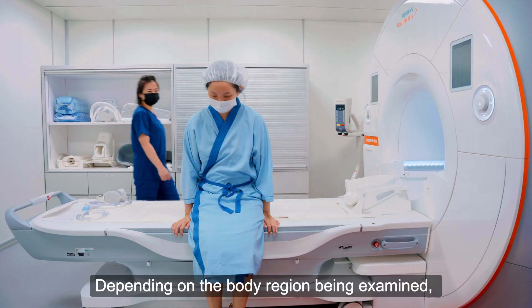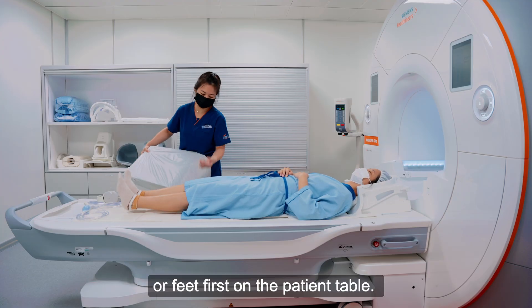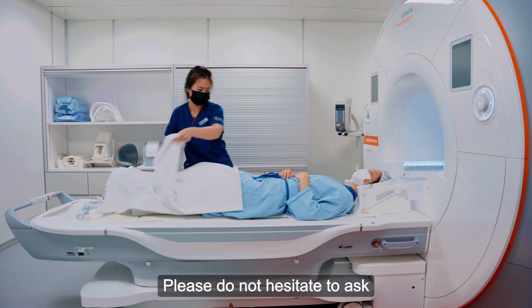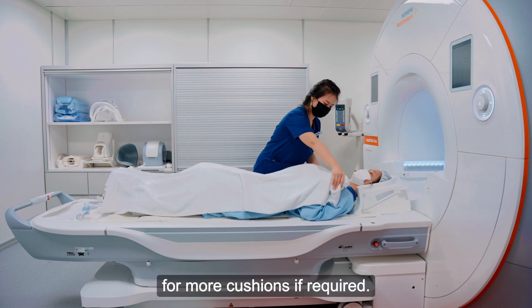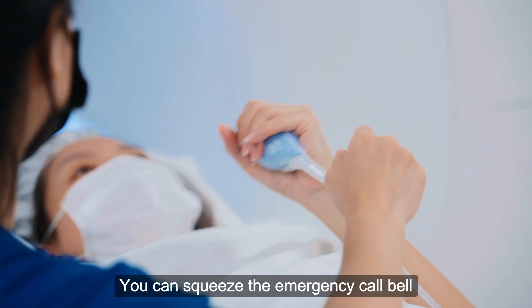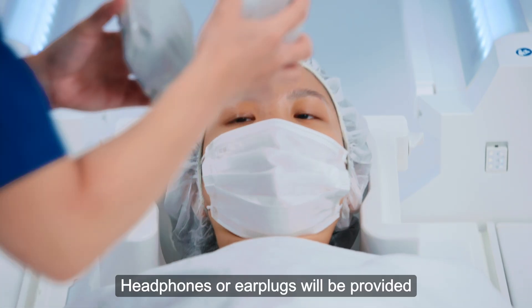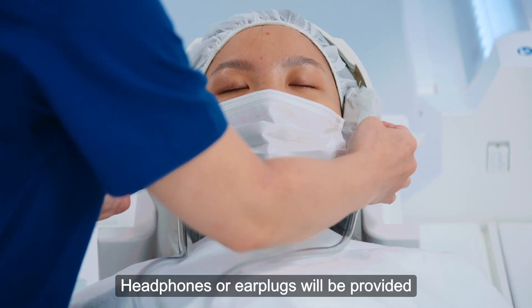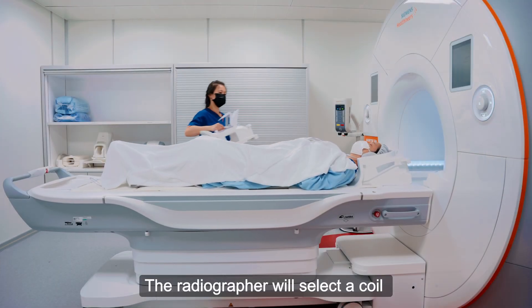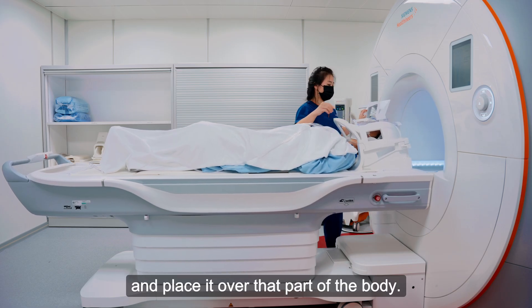Depending on the body region being examined, you may be positioned either head first or feet first on the patient table. The radiographer will ensure your comfort. Please do not hesitate to ask for more cushions if required. You can squeeze the emergency call bell to alert the radiographer if you feel unwell or uncomfortable. Headphones or earplugs will be provided to protect your hearing during the scan. The radiographer will select a coil appropriate for the area being examined and place it over that part of the body.